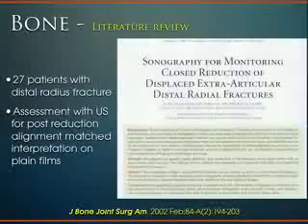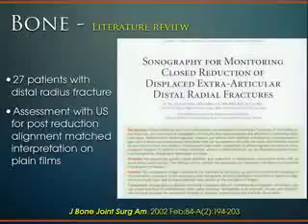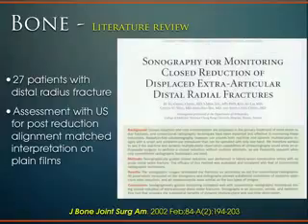And that's true for bone as well. And then as you try to put it into a clinical perspective, so okay, great, I can image it, I can see the fracture, but can I use that to then treat the patient? And when we talk about, especially in an emergency room setting, we're doing reduction of fractures and closed reduction of fractures, and there's this one particular study showing that it can be quite successful with that.